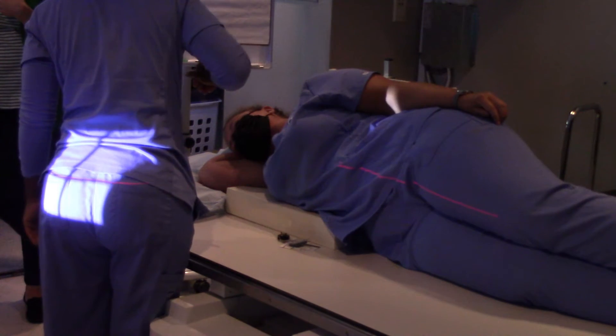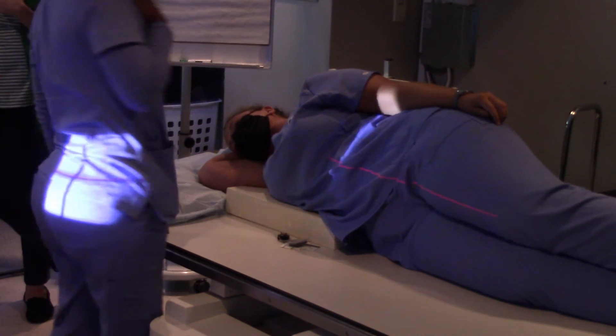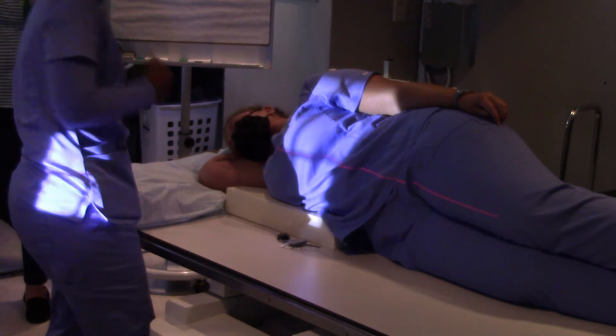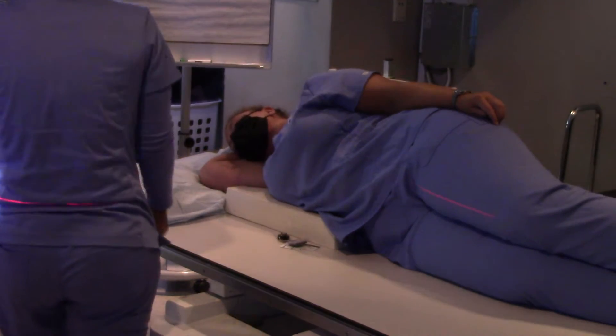What's an anatomical structure that is guaranteed to be midline that we can see from across the room? The jugular notch — or the patient's neck. The patient's neck is in line with their spine.